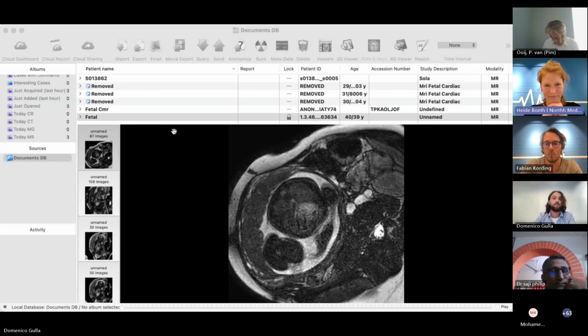And here, for example, this is a case of 27 gestational weeks. So I mean, it's something that is also possible. And in this case, in the upper view on the left side, you can see that scanning the 4-chamber view, we have a movement. This is one of the problems, the movement of the fetus. And here the image is bad.